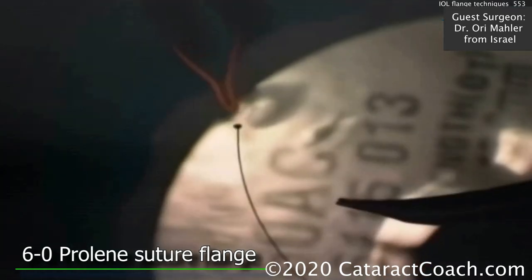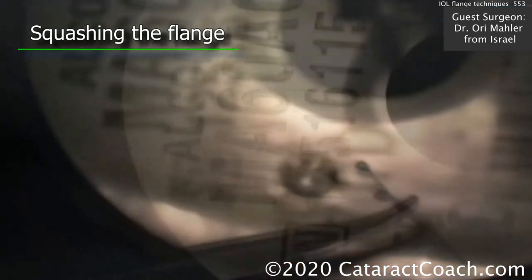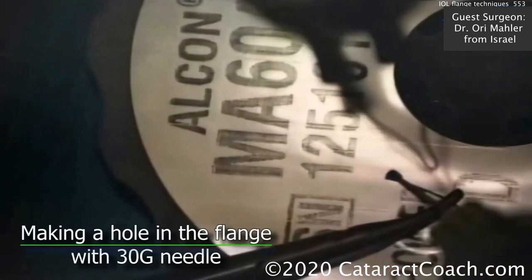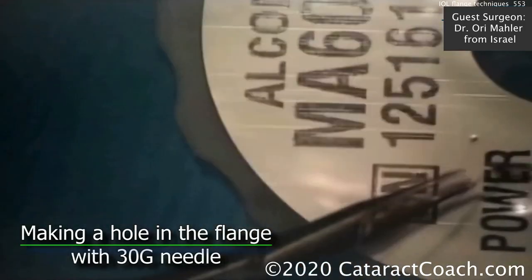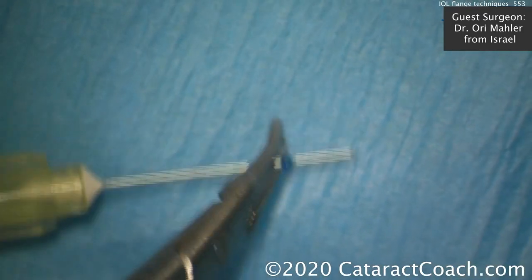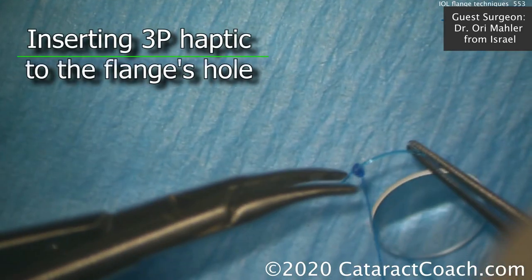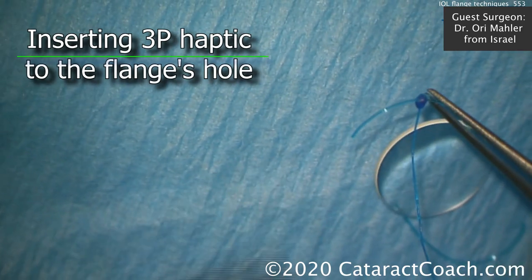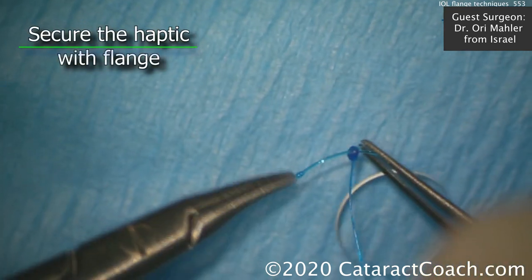The first case needs one flange, one support. Here's a 6-0 prolene — the tip is being melted, then using a hot 30-gauge needle to pierce that and make an eyelet. With this eyelet, you can place that on the haptic of a three-piece lens. And the edge of the haptic can also be cauterized to create another flange as a stop.